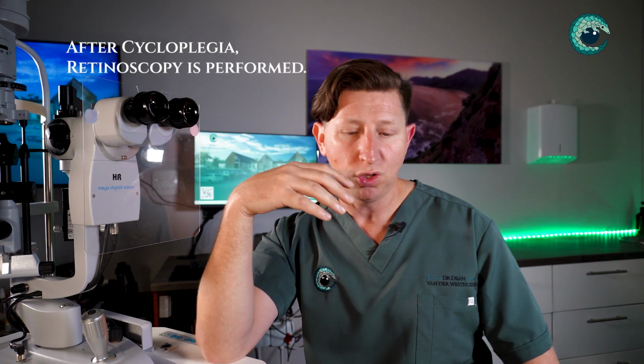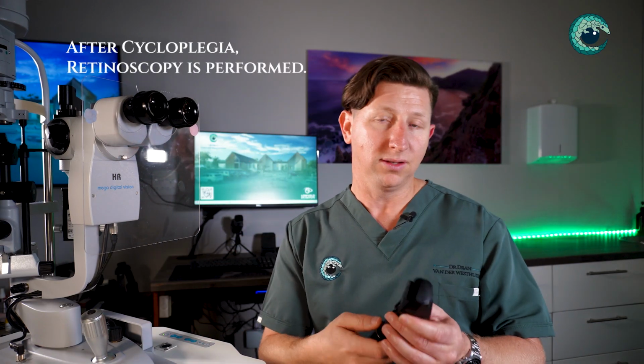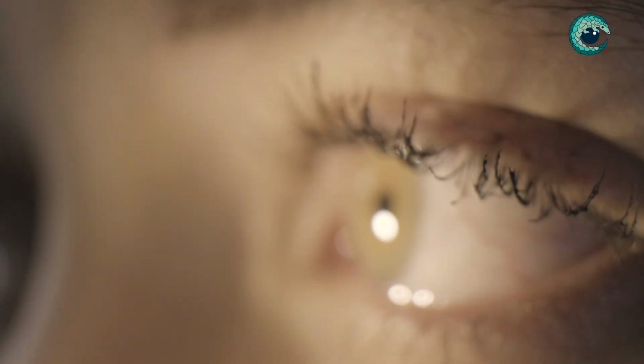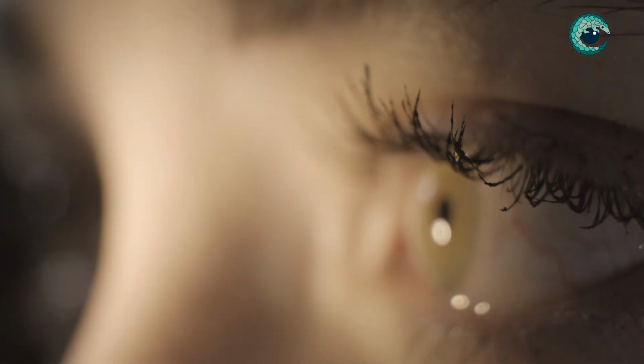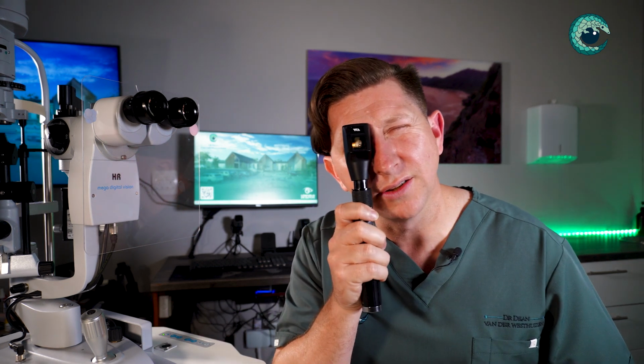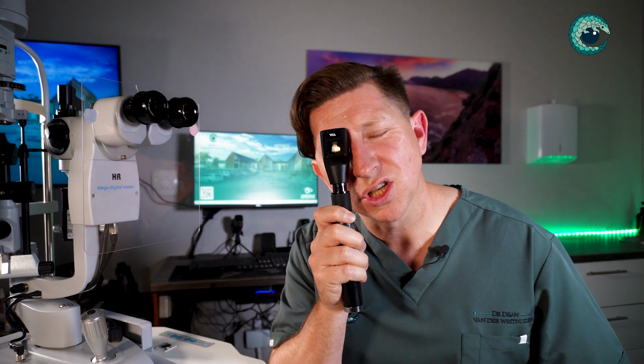So we dilate the pupil, we paralyze the muscles, and then we use a retinoscope, which looks like this. It's a device that has a slit beam on it, which we use to check a light reflex over the child's eye. We look through this hole and into the child's eye, and by shining the light through the pupil, we see a light reflex.